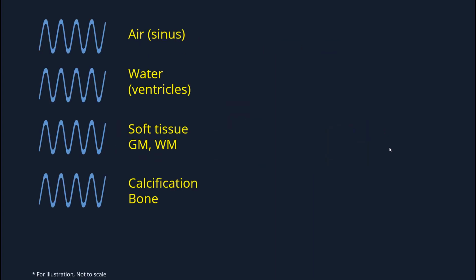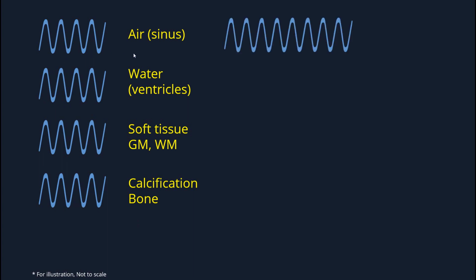This is one of the most important slides, and if you understand it, you can understand how structures are displayed on an image, whether it's a neuroradiology study, a chest X-ray, a hand plain film, etc. It can also help you identify how pathology looks. The waves entering a patient are usually of a very similar magnitude. If a wave passes through a structure like the air in the sinuses, which provides very little density and very little hindrance to the waveform, it exits with very similar characteristics. A very strong waveform is captured by the detector and translates on the image as a shade of black.